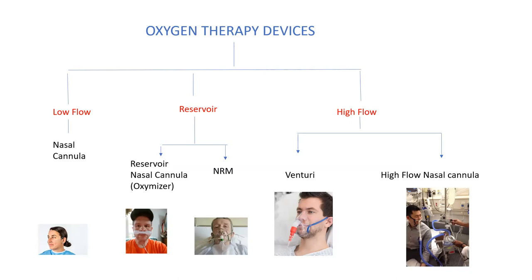So in this discussion, we will look at all the devices depicted in this slide. Following each type, there will be questions that will require you to answer. So let's take a look at these devices, starting with the nasal cannula. I just want to pause here to see if there are any questions so far. Any questions so far?